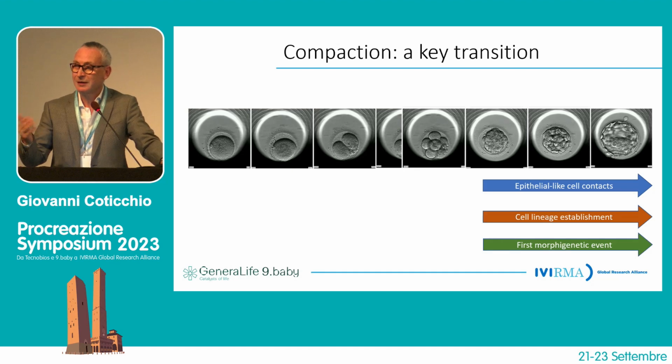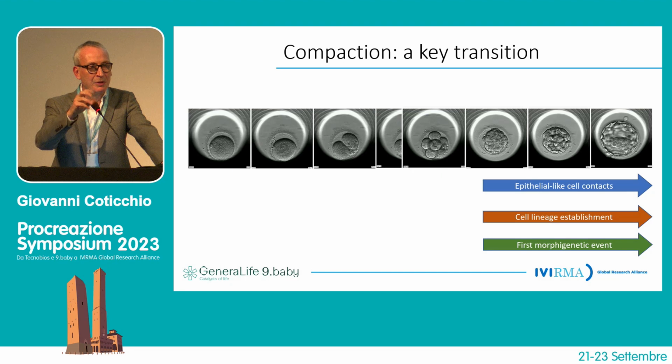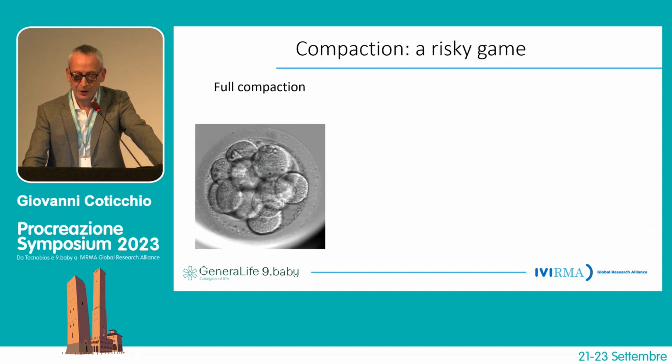But it's not just fertilization, which is, however, a topic that I like particularly. There are a number of other stages in which time-lapse can be harnessed. For example, the transition from cleavage to blastocyst. And this is very special, not only because many embryos arrest, but also because it is the first manifestation of a morphogenetic event. So, development in action.